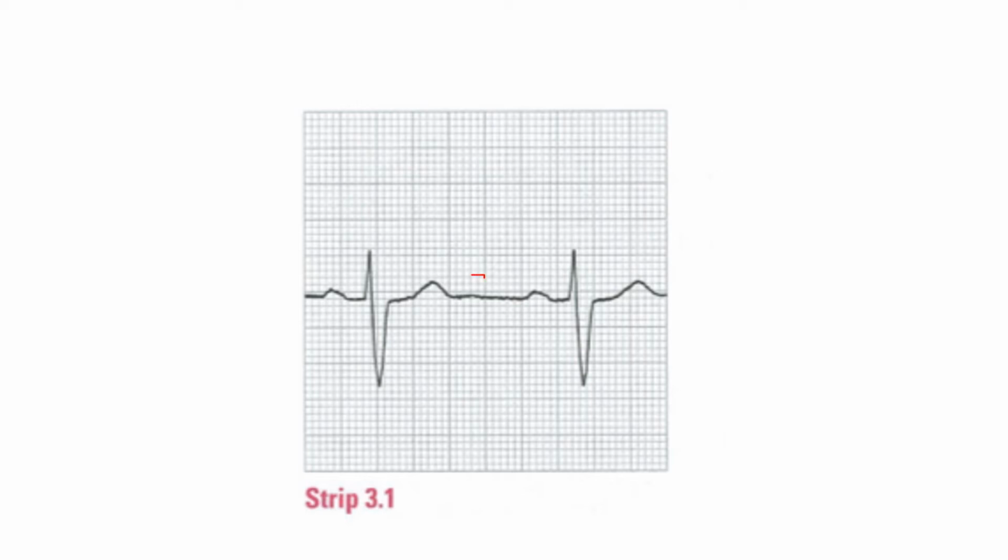And did you notice that this is considered a U wave? It's very low voltage. As I said, you possibly could miss it, but if we had a longer strip, it'd be a lot easier to see.